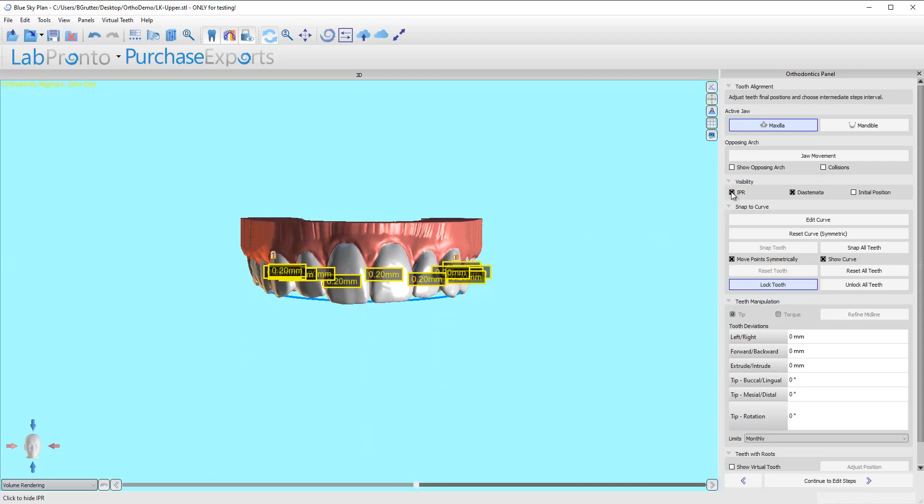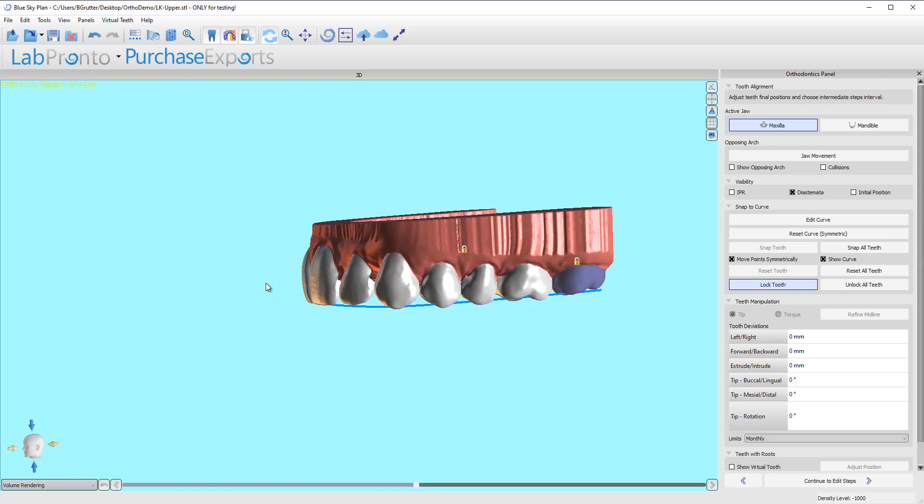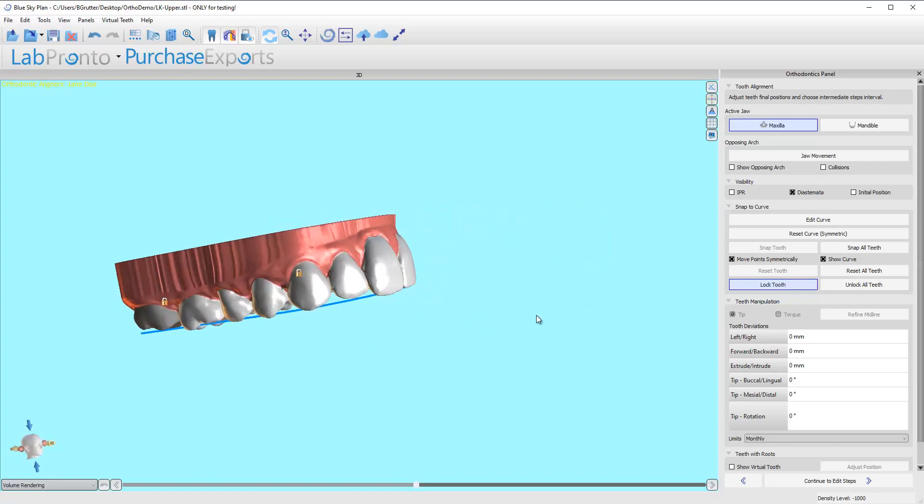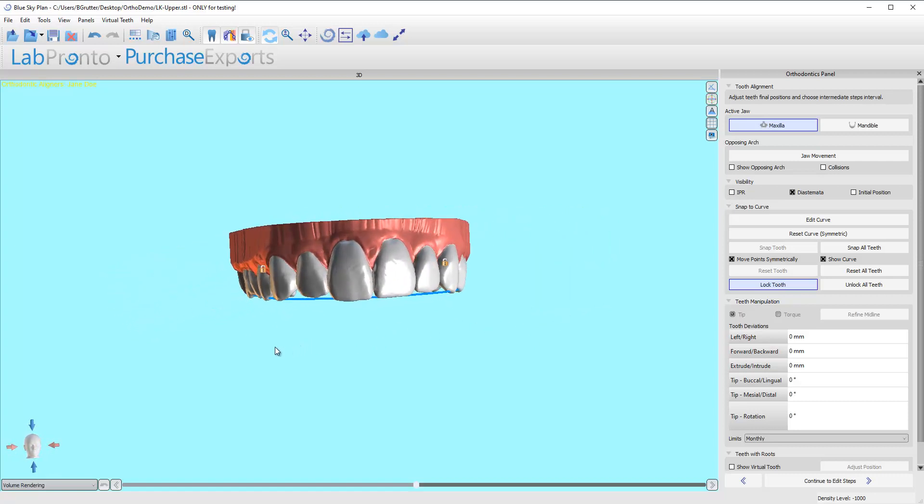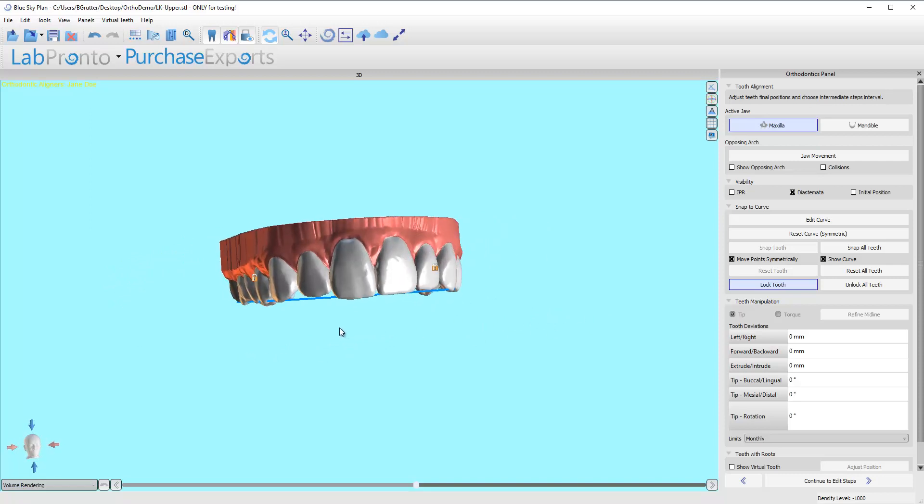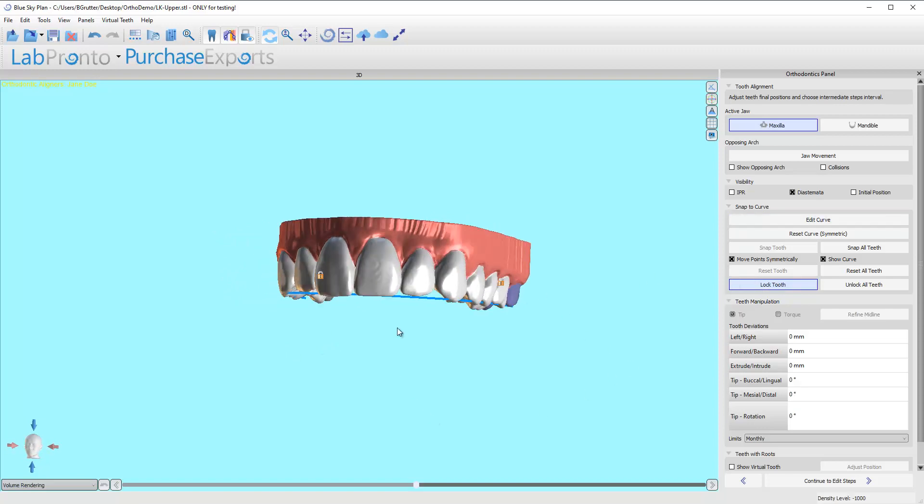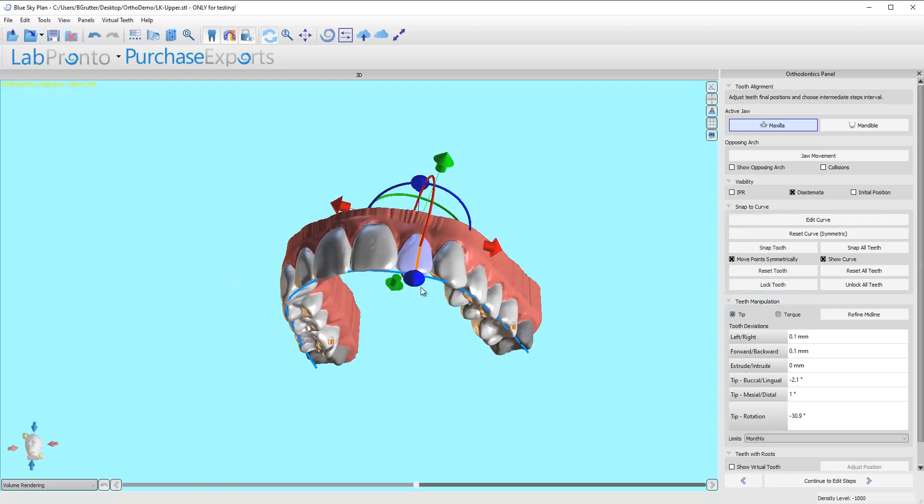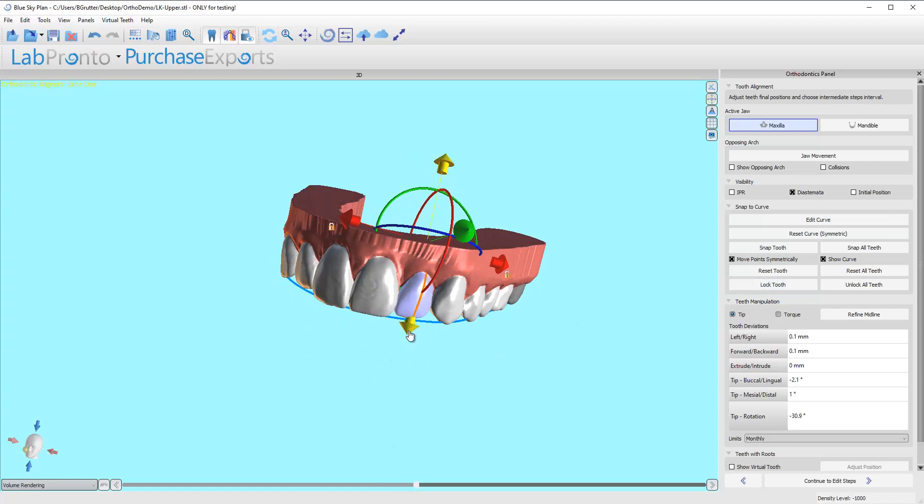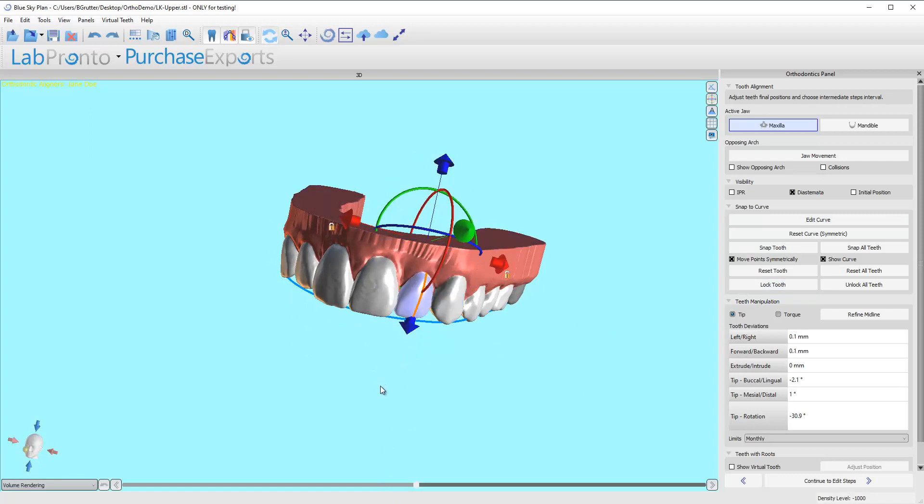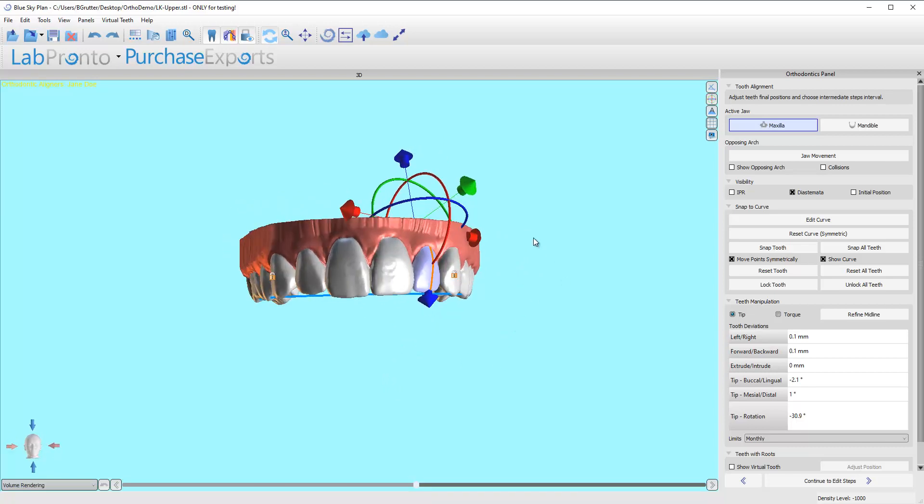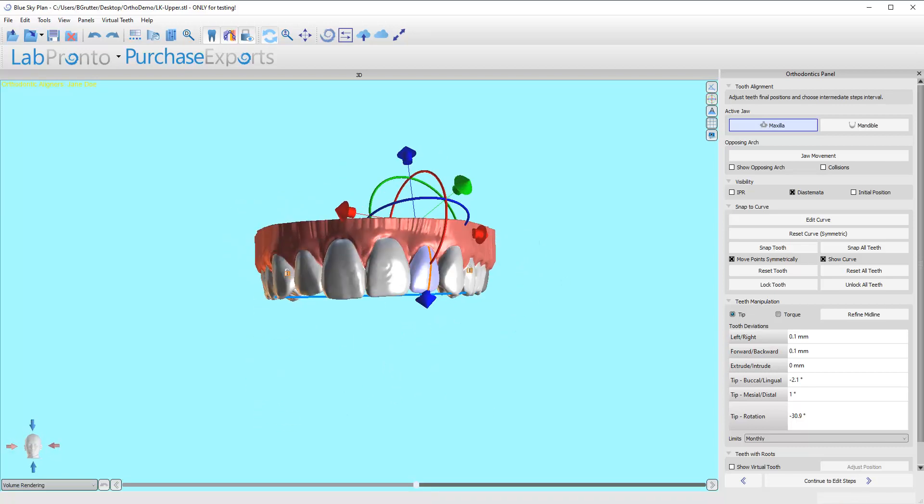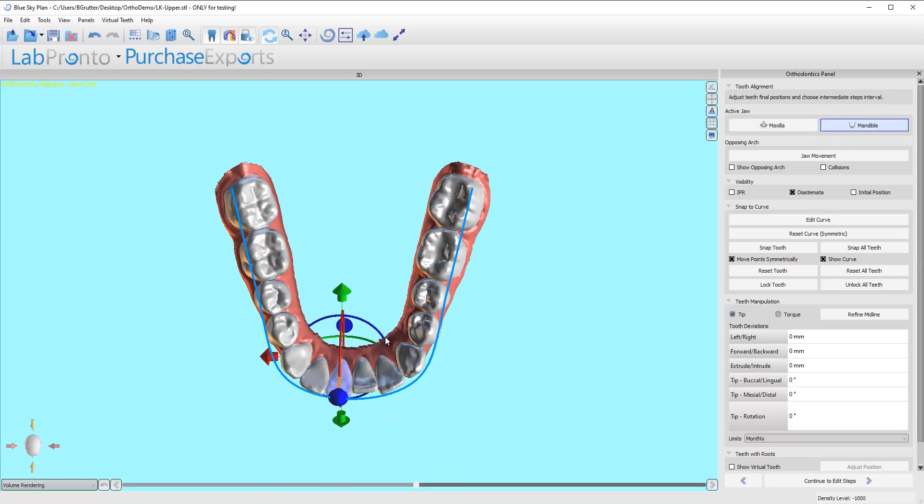I'm going to turn that off for now. Now I'm just looking at incisal-gingival relationship—do I need to intrude or extrude teeth? Truth be told, I don't. Her case is great. I don't need to mess with any of that, so I'm not going to. If I wanted to, I can grab a tooth and move it down individually. Don't like that—Control Z to undo it. But these arches are looking pretty darn good to me. So now I'm going to go down to the mandible.